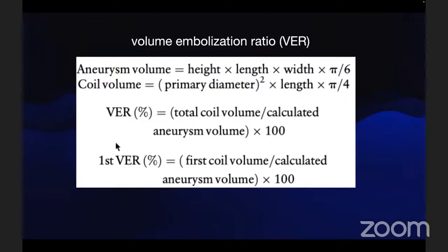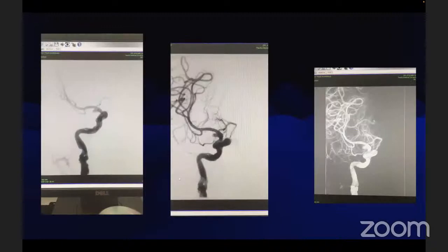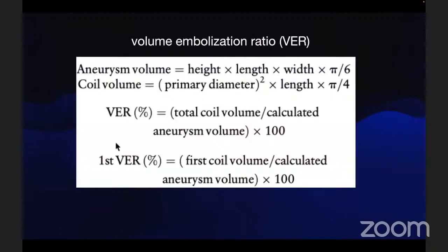Usually, is anybody doing the calculation in India? No, sir, that is what I wanted to ask. How do you approach taking the coil size, sir? Regarding coil size, we usually take the width and the height and the ratio between the two. If the width is 9 mm and the height is 7 mm, we usually take an 8 mm coil, an in-between size. Okay.